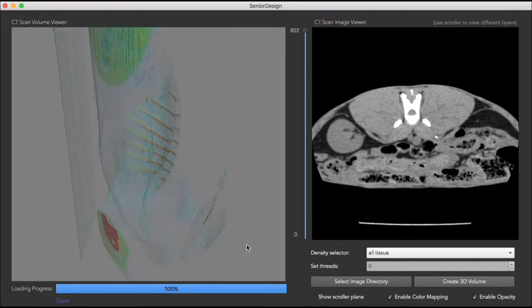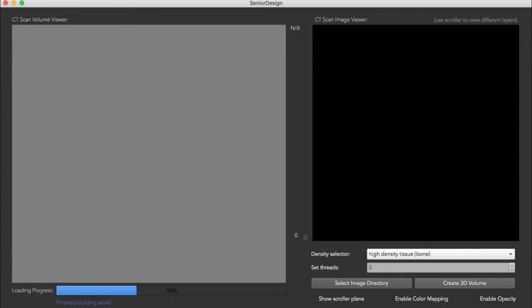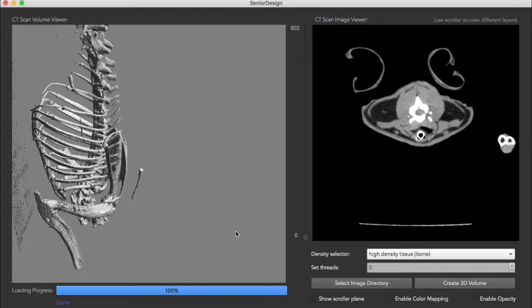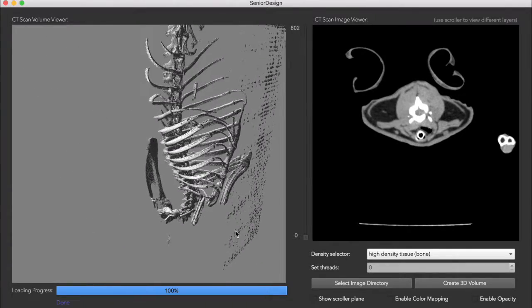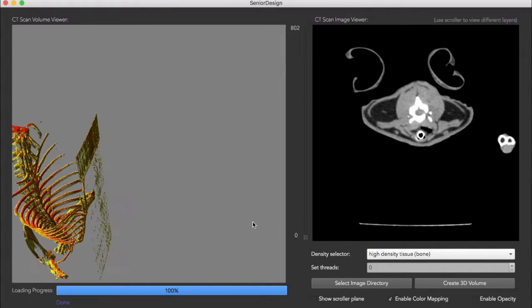One of the biggest challenges I had in my project was thinking about speed and optimization. Unfortunately, when I first ran this, to get all 801 layers rendered took up to 45 minutes, which was prohibitively slow. What I was doing before was when I took in each of the images, I created what was called a world, which was basically a map of tuples. So the 3D address of each pixel from each image in 3D space, stored in a map.